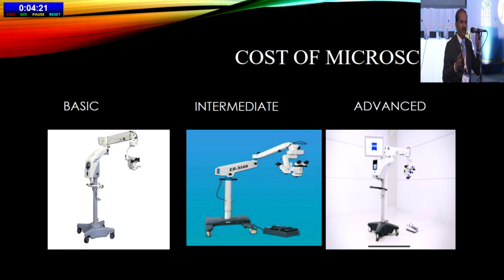And when you're taking a demo, one suggestion which I would like to make is, never operate one OT with OmniGlow and compare it without OmniGlow on the next sitting. So never keep switching. Use OmniGlow for 3 continuous sessions and see how it works. It holds good even for your phaco machines also. When you have 2 machines and are trying them, you'll never be comfortable with either. Use one machine for 3 sessions continuously, look at your experience, and then decide. That's what I would like to suggest.